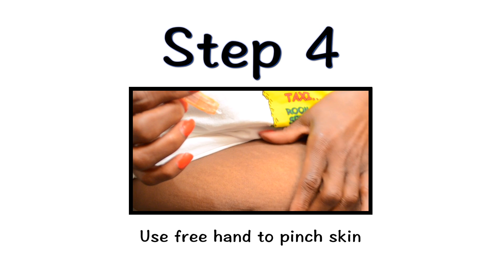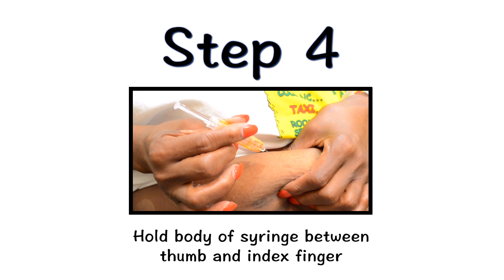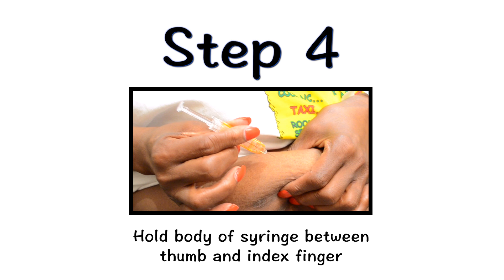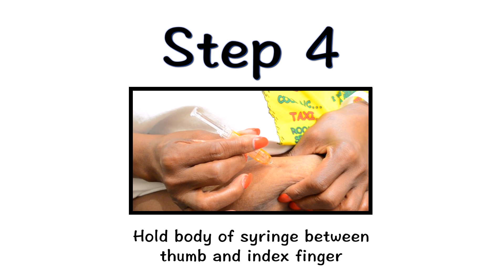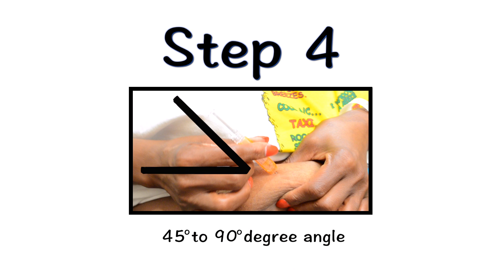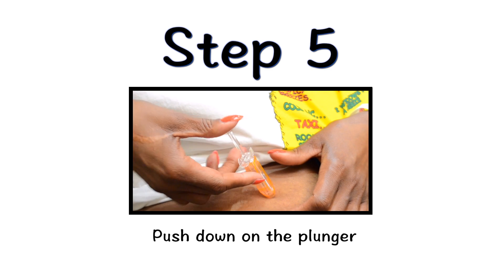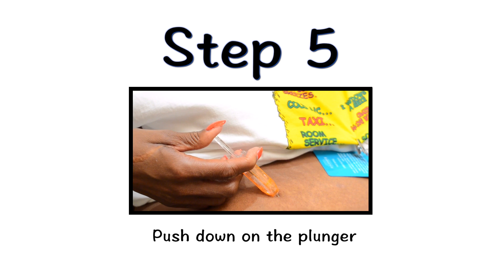Use your free hand to firmly pinch the skin you've previously cleaned. Hold the body of the syringe between your thumb and index finger. Do not hold or push on the plunger while inserting the needle into your skin. Use a quick motion to fully insert the needle straight into the pinched skin at a 45 to 90 degree angle. When the needle is inserted, you can release the pinched skin. Push the plunger down, injecting all of the Neupogen.